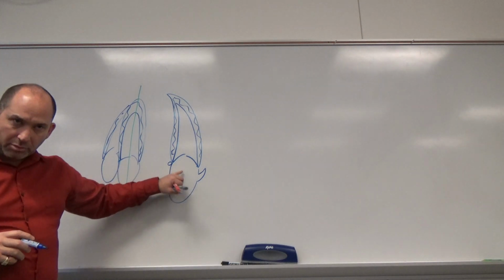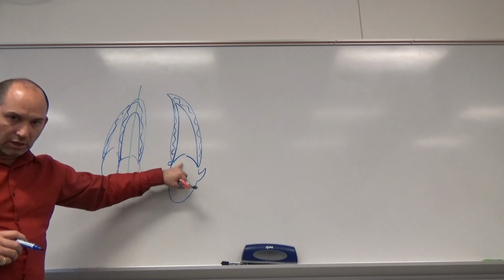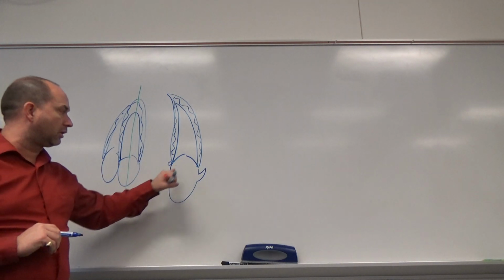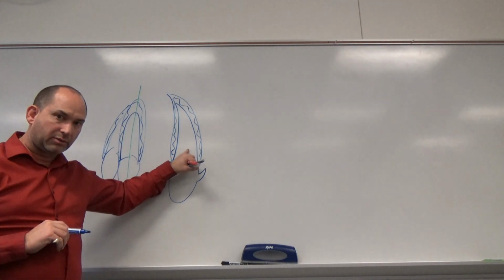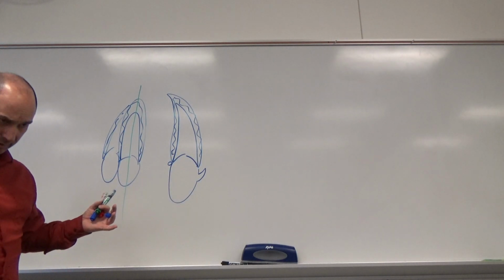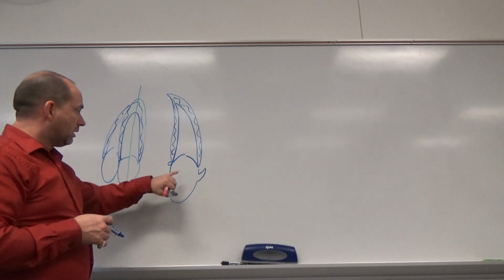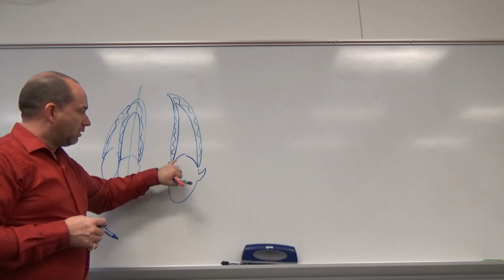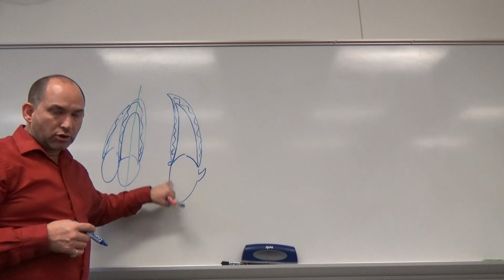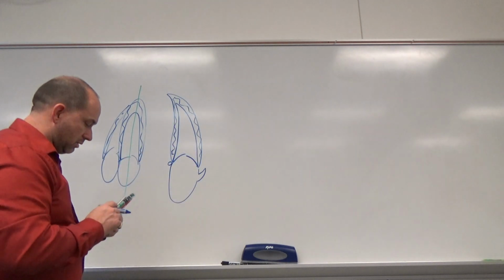We're going to take a 2D clip of this, and then we're going to put color Doppler over this, showing the color flow through this. If there's something going on, we're going to take another pulsed wave Doppler of that valve, but typically we don't do anything further than what we did in the 4-chamber unless there's something wrong. So that's fine.